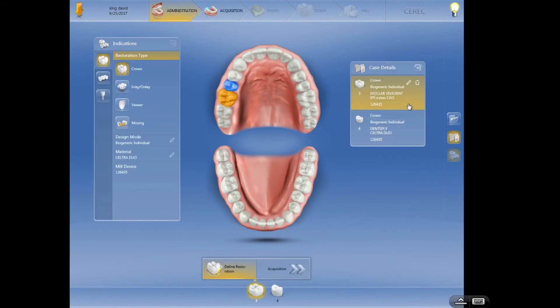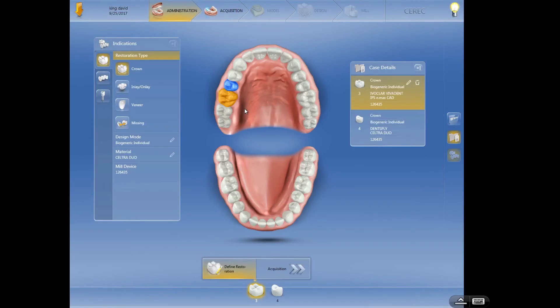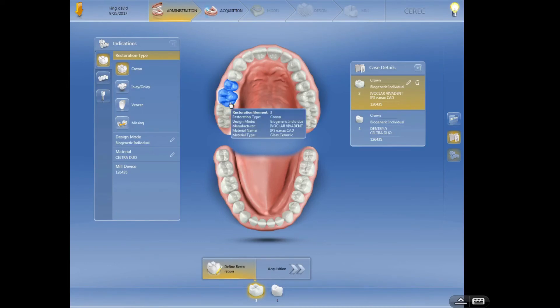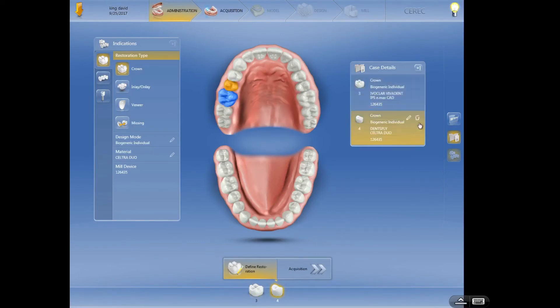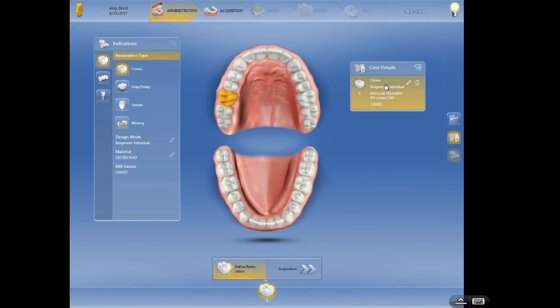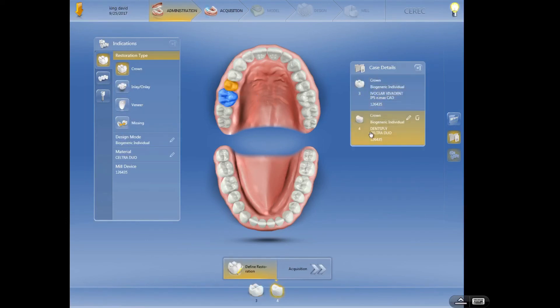Now what if we start the case and the patient comes in and the assistant's already got everything set up, the patient says I only want to do one crown a day, let's do the worst one. You talk to the doctor, the doctor says okay we're going to do number three, so we need to delete number four. Same thing, click on tooth number four, use your trash can, delete. Now if they change their mind again, it's easy enough to add back in there.